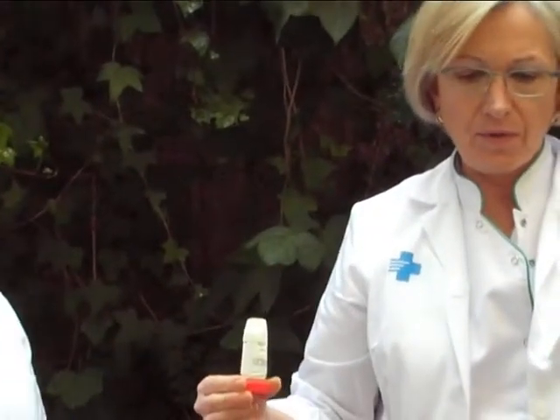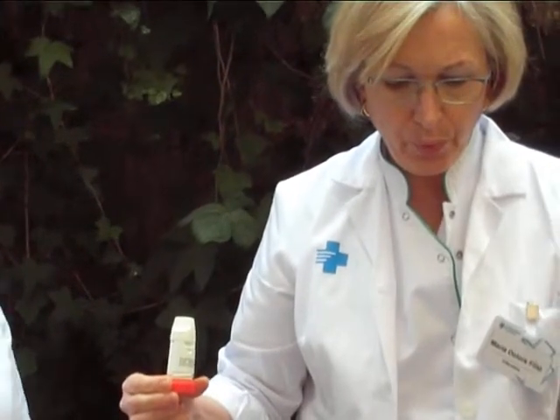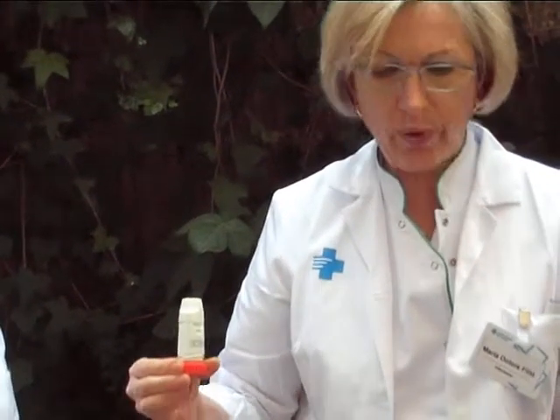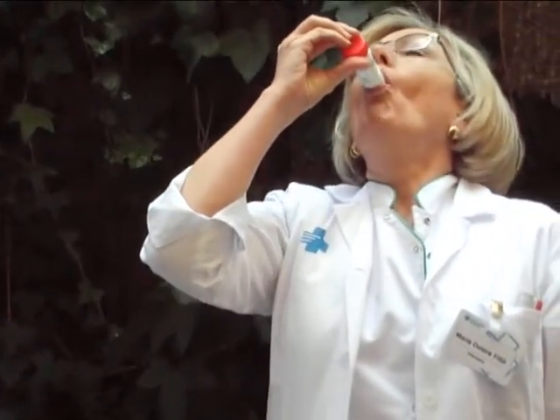Breathe out gently while keeping the inhaler away from your mouth. Place the mouthpiece between your lips and breathe in through your mouth as deeply and as hard as you can.